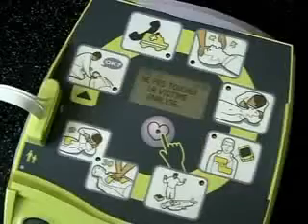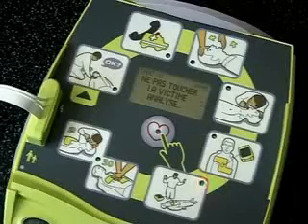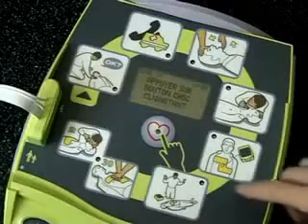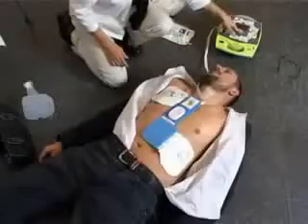Ne pas toucher la victime. Analyse en cours. Choc conseillé. Ne pas toucher la victime. Appuyez sur le bouton de choc clignotant. Choc délivré.